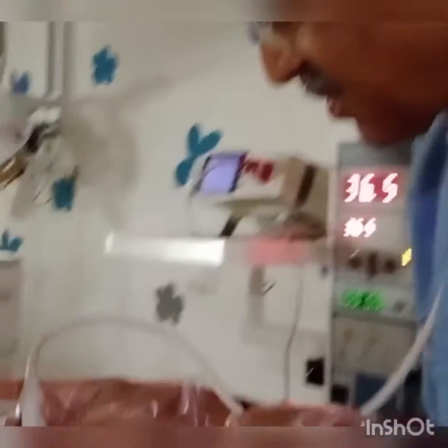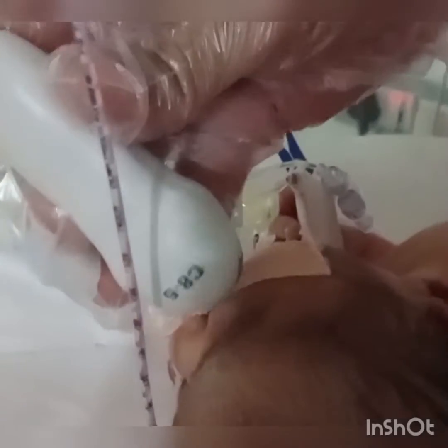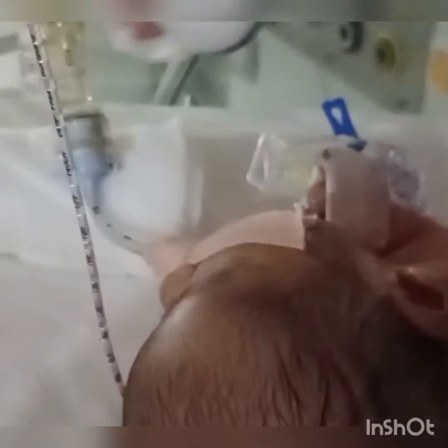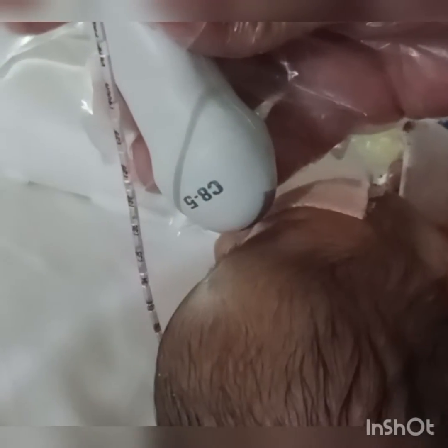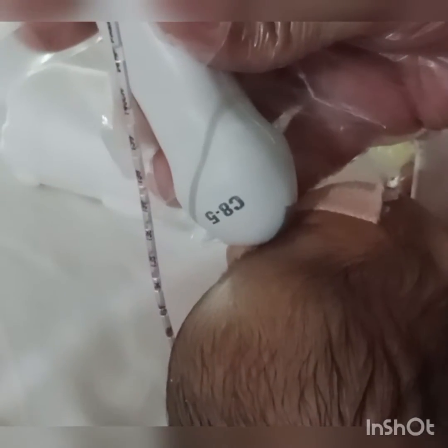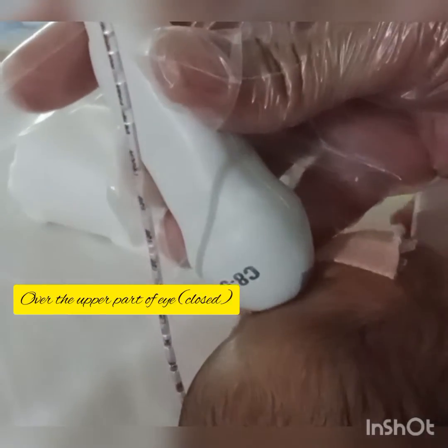You can see here I am keeping the probe exactly here. The eye is closed and I am not using anything — you can just wipe it and keep. And the image you can see there.